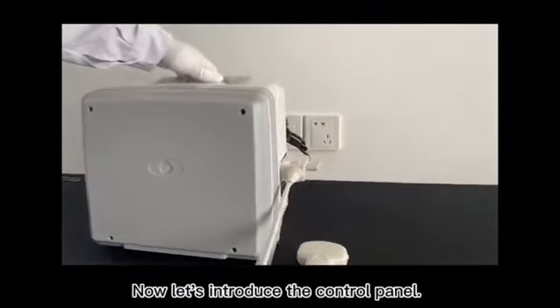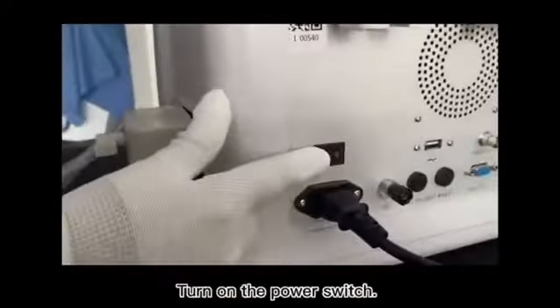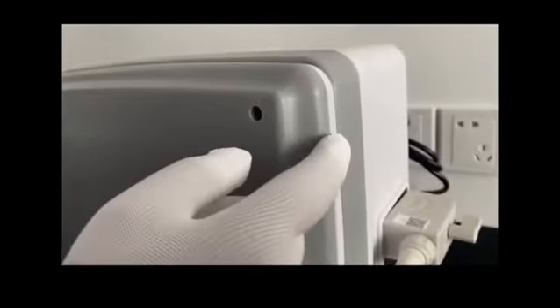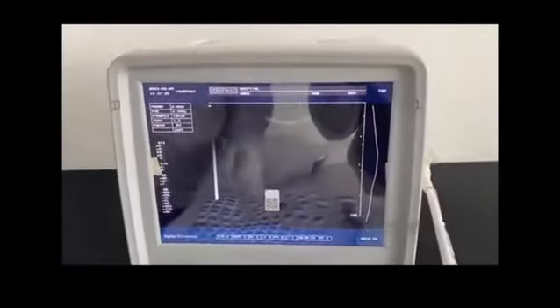Now let's introduce the control panel. Turn on the power switch. Press the clips on both sides of the keyboard. Take out the keyboard. After booting, our interface display looks like this.